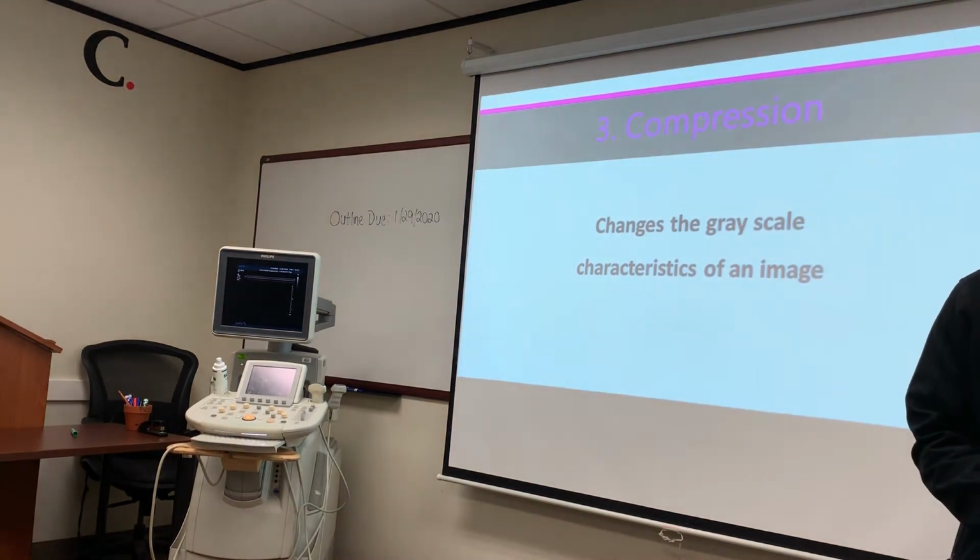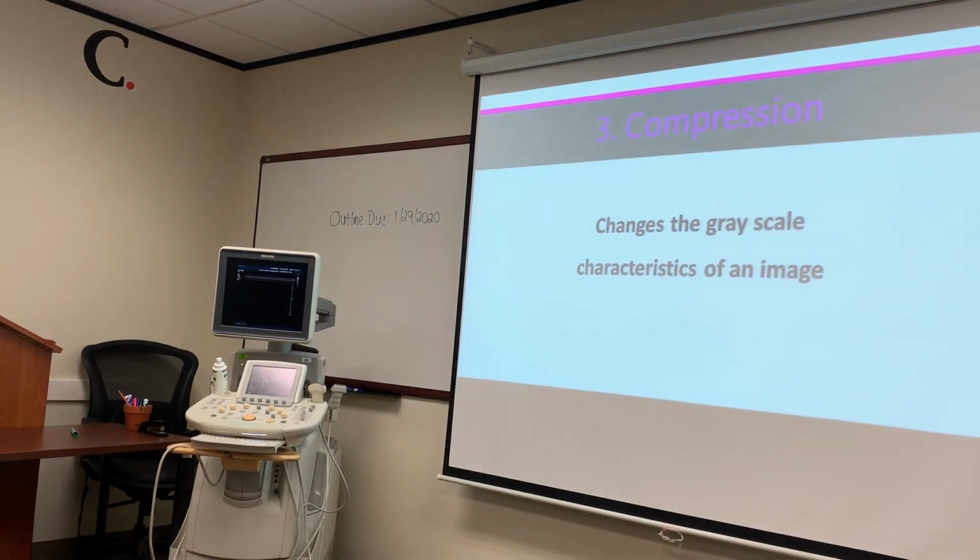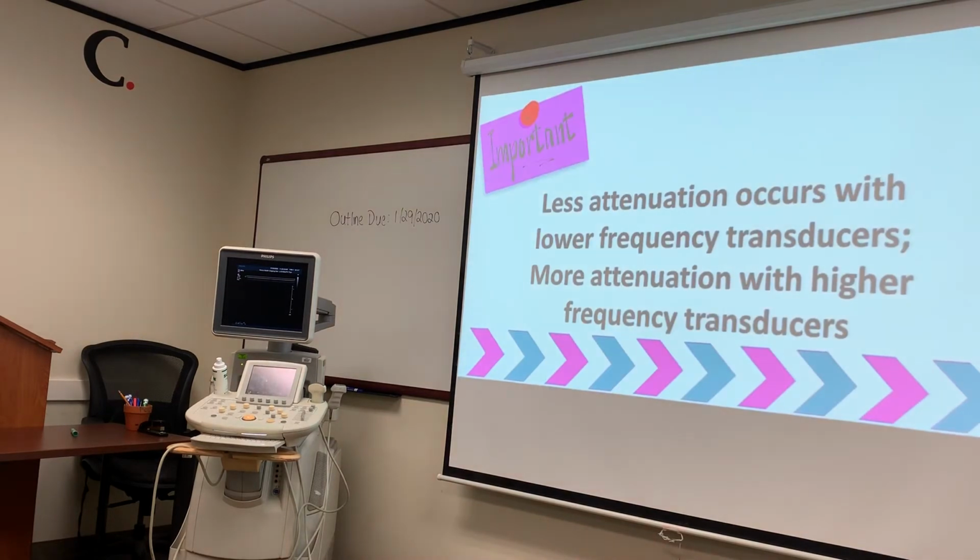Use your common sense. Because you know how high frequency and low frequency transducers affect an image. You know that high frequency transducers are going to be used for shallow, superficial structures. Right, Myra? We proved that one day in the lab when we were looking at thyroids. Myra, never forget that. She answered that question right forever.